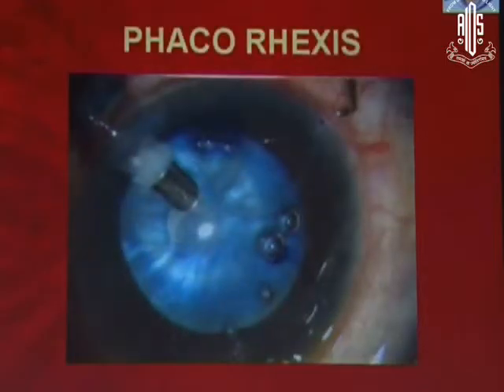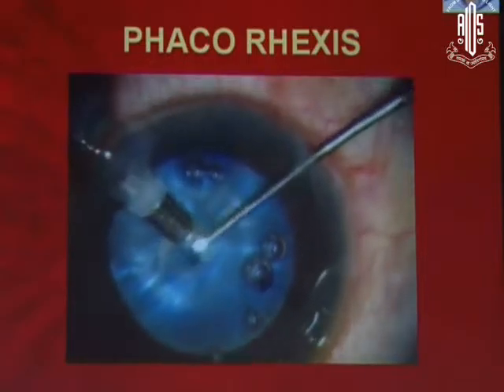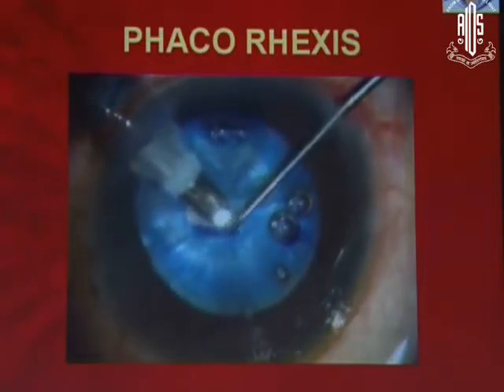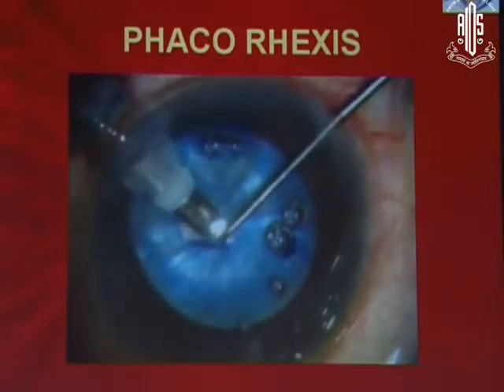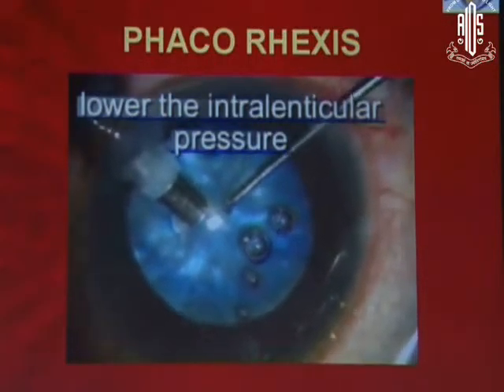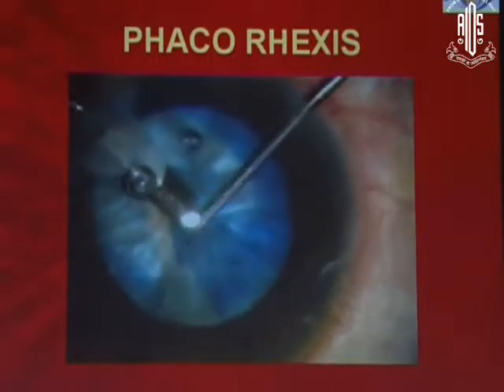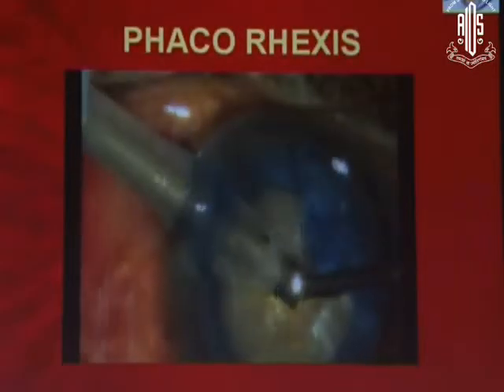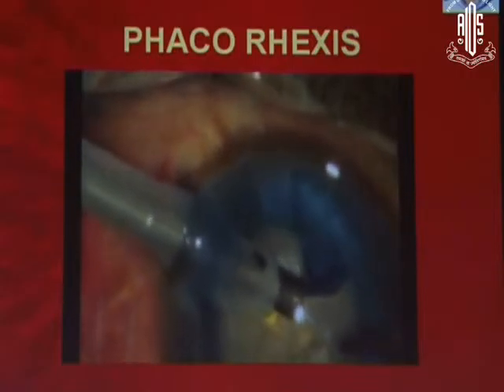Or if you want to just convert — this is a patient you can see here — you can convert this punchorexis into a phaco rexis as well. With the phaco needle itself, once you punch it, you can decompress the intralenticular pressure very, very fast with the phaco needle because the phaco needle is much bigger. So you can go ahead using the second instrument or the Sinski hook with a double-handed technique and do the phaco rexis as well. You can see here how it has been done with the phaco needle and you don't require a cystitome or a Utrata forceps.